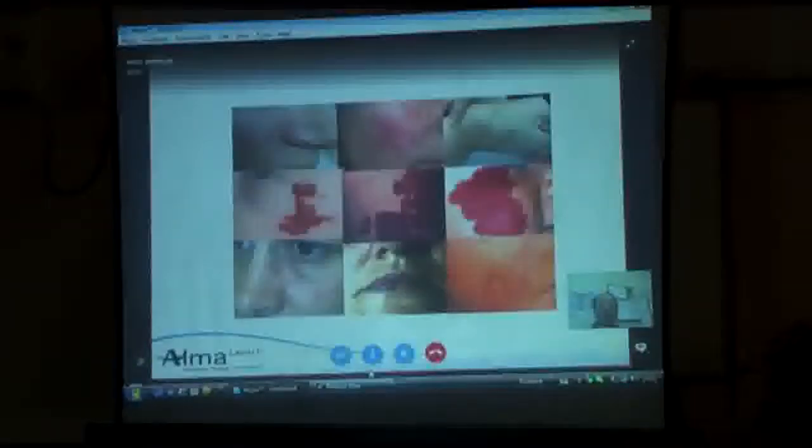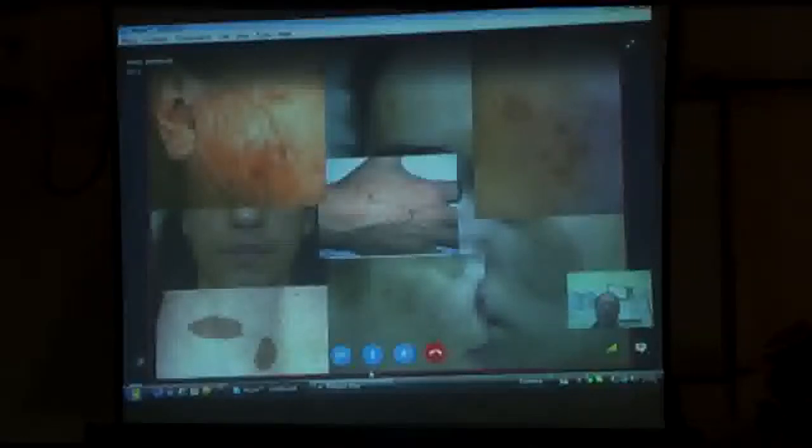So these are just some examples that you're all familiar with from the clinical point of view, some imperfections of vascular targets that we want to aim at with lasers, starting with, of course, the pulse dye laser or Nd:YAGs or KTP. And these are other types of imperfections, pigmented lesions, which we want to target with lasers that are more sensitive to melanin.